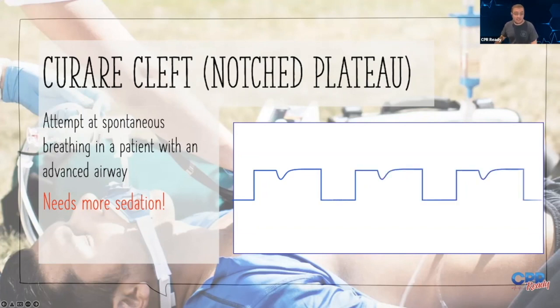So you should not see this when you're managing somebody's airway. That means that they're attempting to breathe through what you're doing. So go ahead and follow your protocols for giving them some extra sedation so that you'll be able to bag them without them interfering with it.